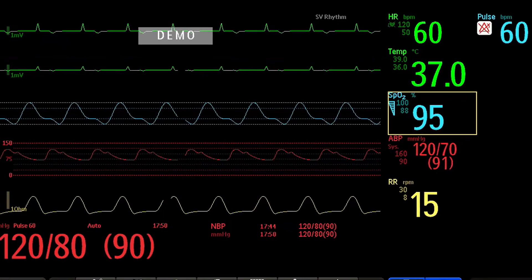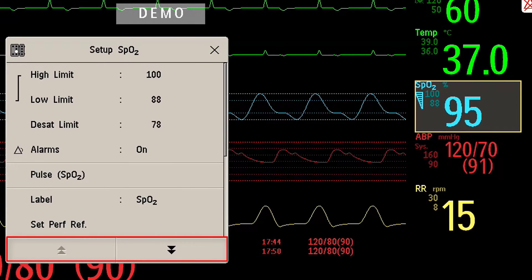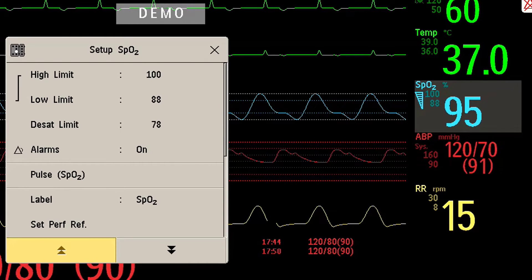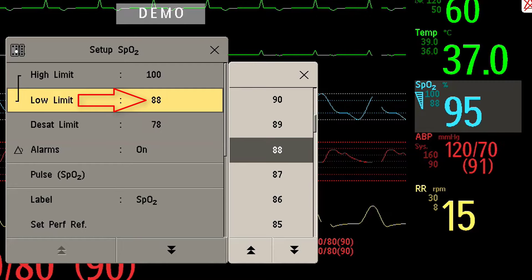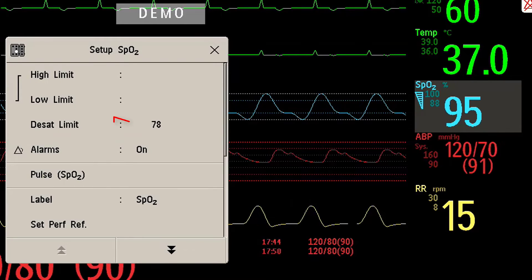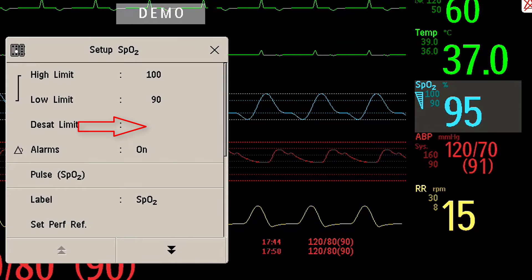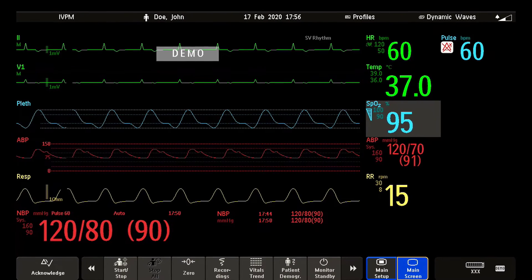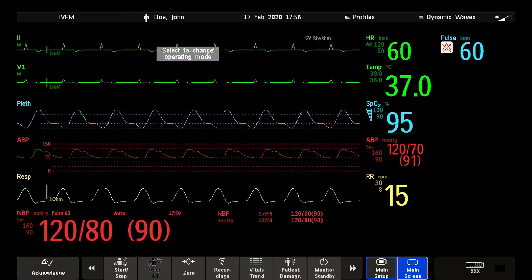Here you see the SPO2 setup menu. In the menu, you can scroll down and up using the arrows. I now want to adjust the lower alarm limit and the threshold for the desaturation alarm. I have now selected the new alarm limits and can close the menu — there is no need for additional confirmation. If you need to learn more about alarms in your Intelliview patient monitors, watch the alarm management tutorial.